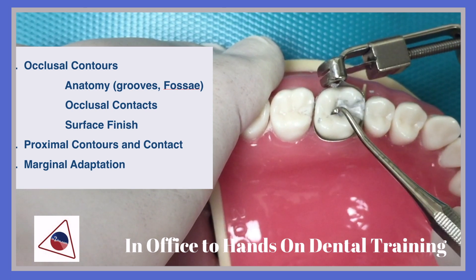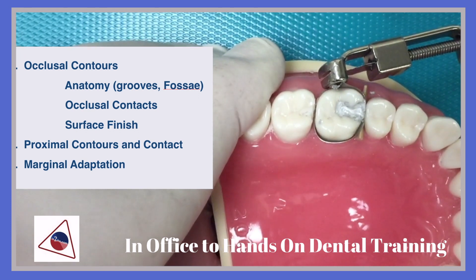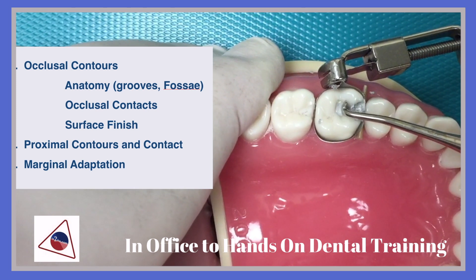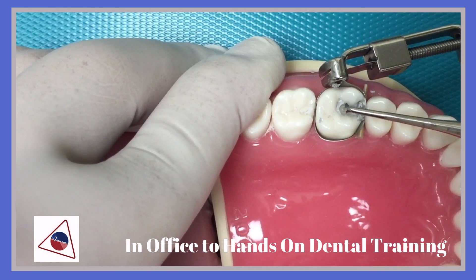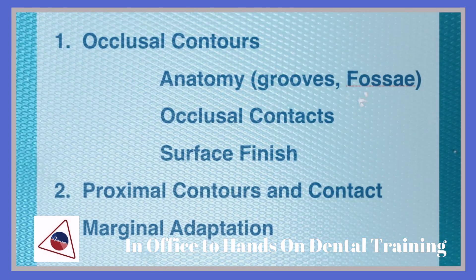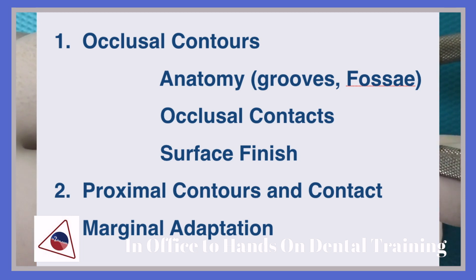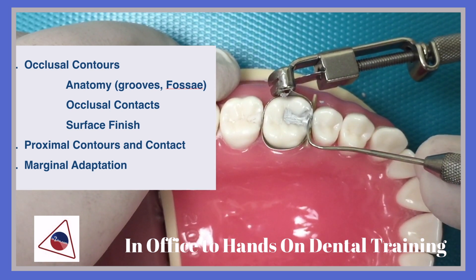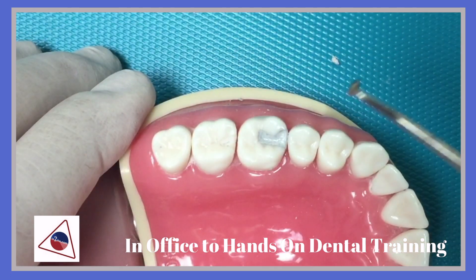After condensing and carving the amalgam material, you are ready to carve the excess amalgam beyond the margin. You want to make sure that you are removing all excess and flash from the marginal area. Carving in the grooves, centered buccal and lingually. Being able to develop the embrasures using the explorer, ensuring embrasures are symmetrical with the adjacent teeth.